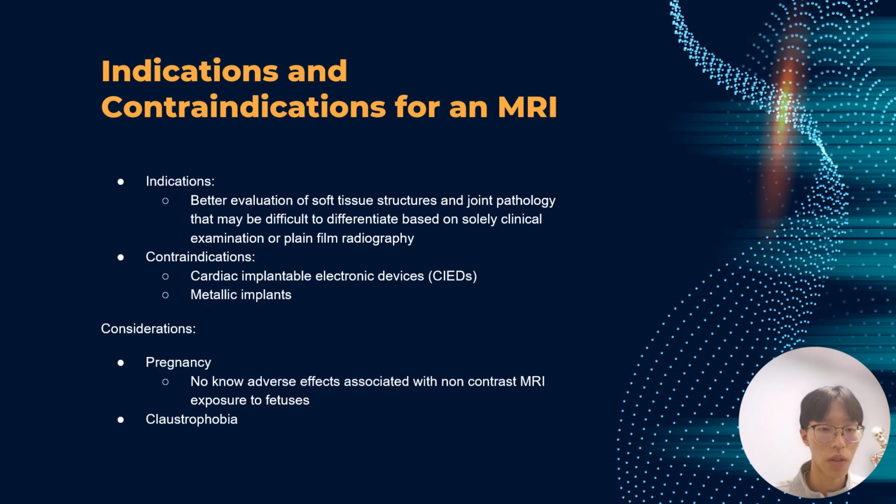In terms of other considerations, pregnancy is generally accepted, but if there's any contrast that's required, it's generally avoided if the patient wants to do an MRI. And the second consideration is claustrophobia, which can be very important for MRI because of the device.